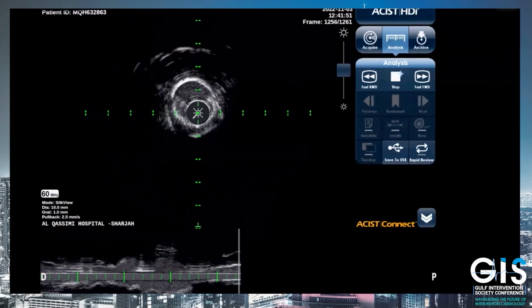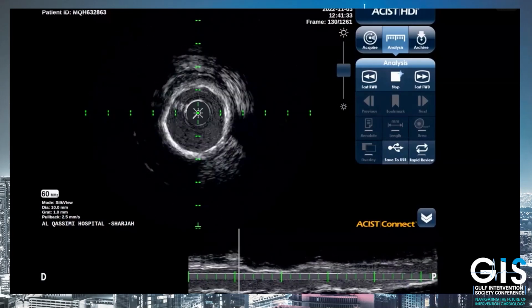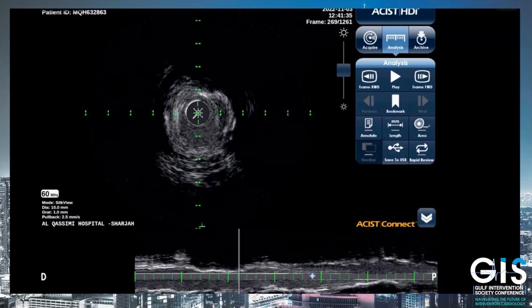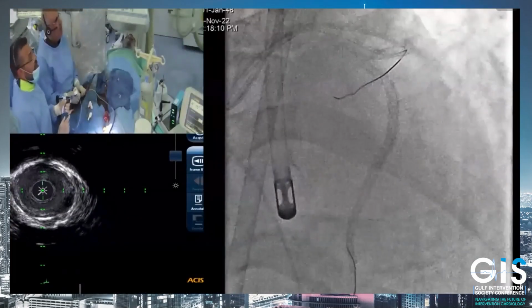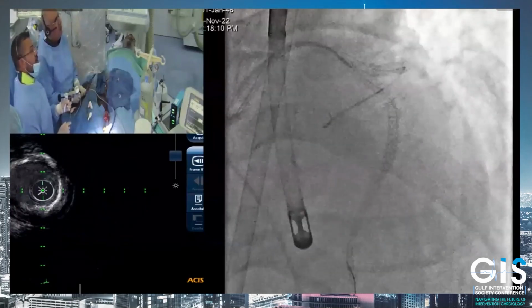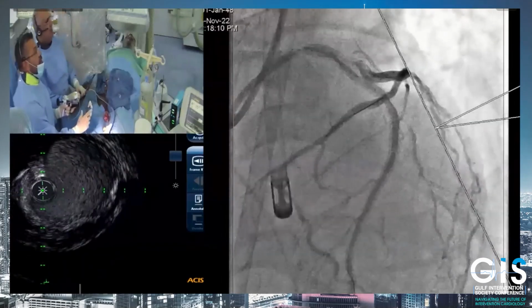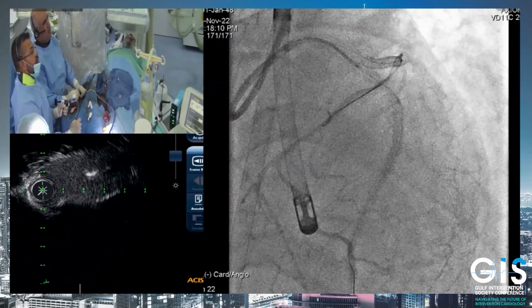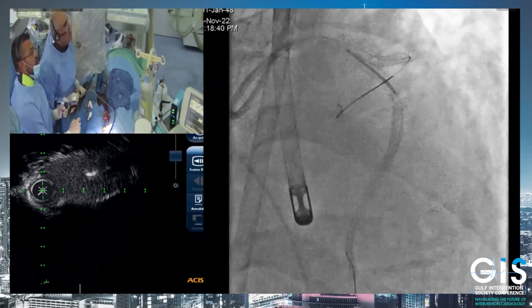But let us say first, let us cross that angulation. I am a bit skeptical. I just wanted to mention this is quite tough angulation, actually. So you will see we choose the 3.5 stent, 22, and I'll follow it with the 4, 22 to the left main. They claim that it's having the lowest crossing profile. So this is going to be my left main to here. I'll take that as a landmark. Save that one, please. So this is 22. I take another 22. So if I go from here to here, this will be another 22.